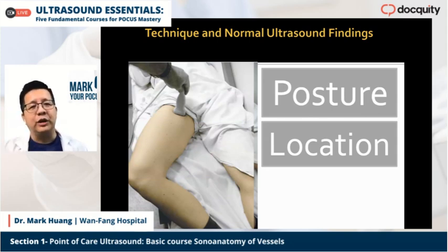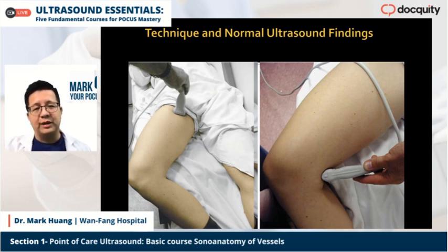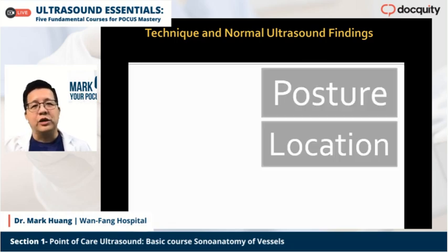The first place you put your probe is on the femoral artery and femoral vein, and the other place is the popliteal artery and popliteal vein in the popliteal area. So this is a 2 point scanning, and it will help us to identify or differentiate the DVT problem.